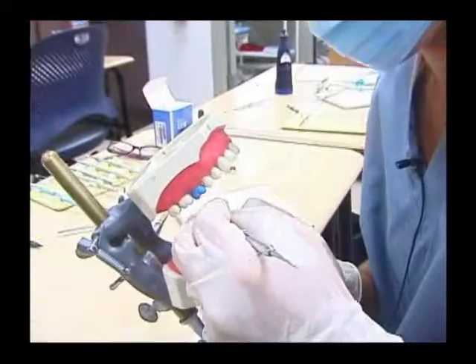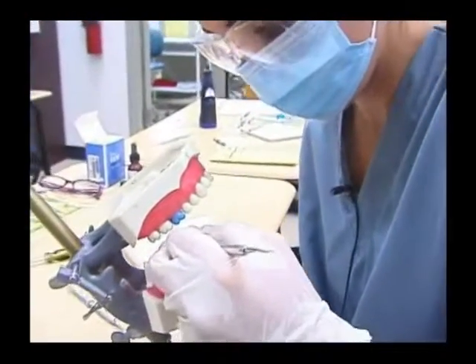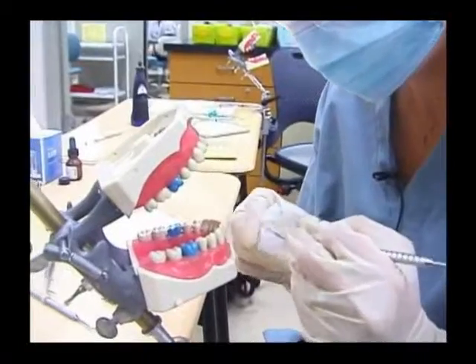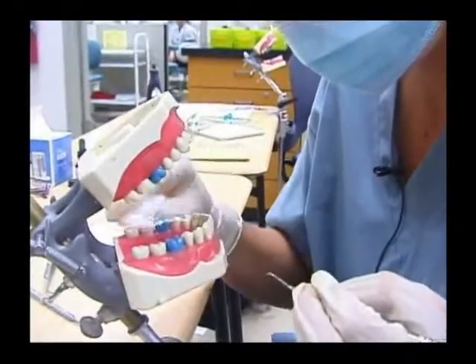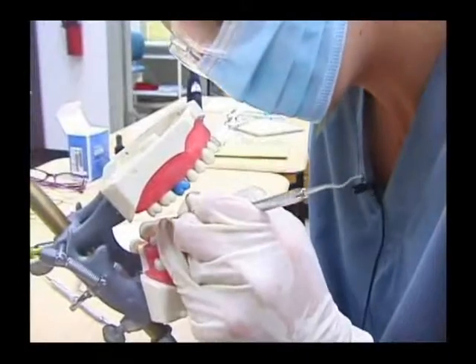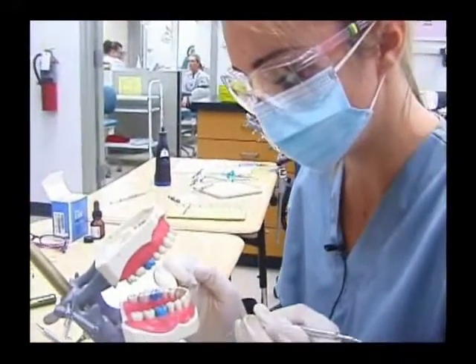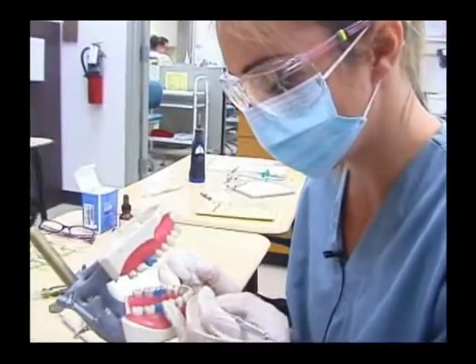Basically we're just carving away to make sure that our margins are going to be sealed. It takes a little bit of work. You're going to make sure that you have a fulcrum using your ring finger on each side of the mouth.